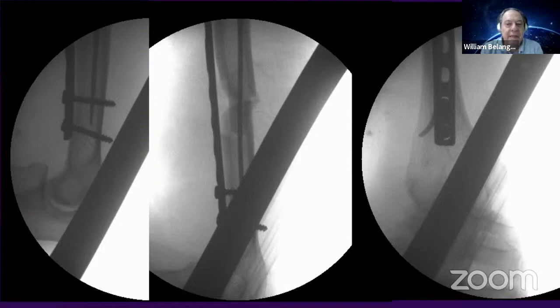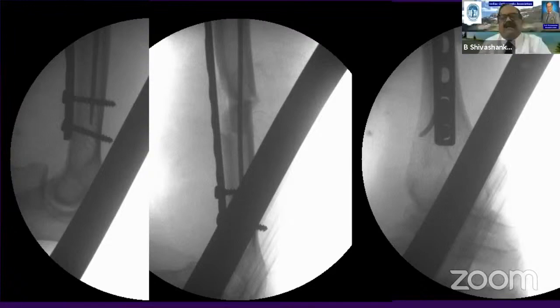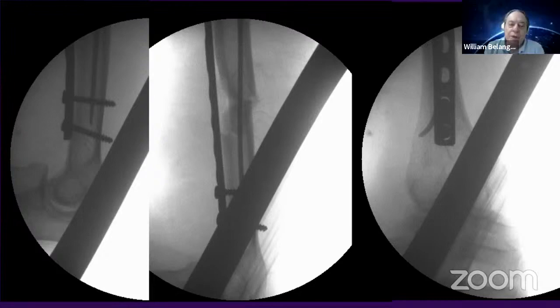I like this approach, Shiva. Sometimes I use this from the distal to proximal to stabilize the fracture. When we have more unstable fractures, I use it, and I put the plate and then I take it off. Okay. Yeah, I like it. It's another possibility. Yes. Or use external fixator or use this technique. I like it very much.